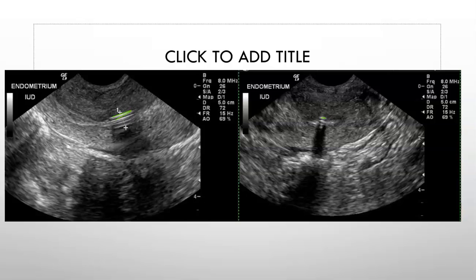But what she didn't realize was that this was a GE machine, and there's a particular speed error artifact that is known with the GEs that occurs when there's a significant difference in the speed of one object, such as a metal IUD and soft tissue, that actually causes it to be placed on the image anterior to where it really should be.